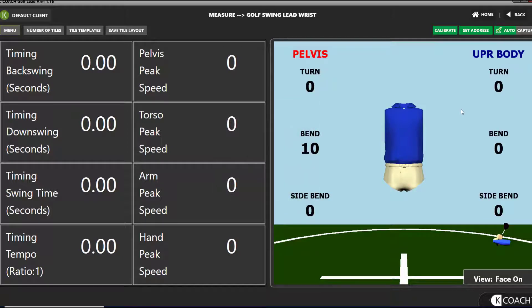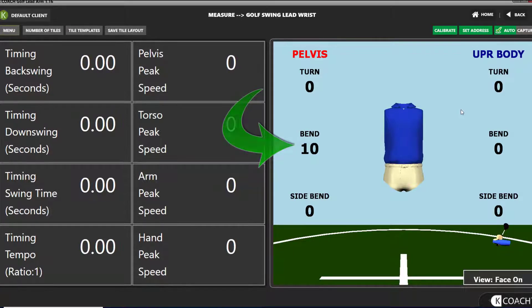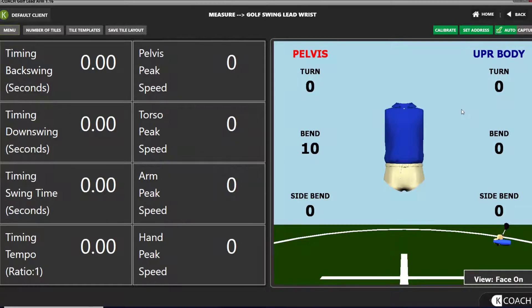Please note: after calibrating, the pelvis bend number will be 10. This is because the default pelvis offset is 10 degrees. The numbers for all the other metrics will be 0.